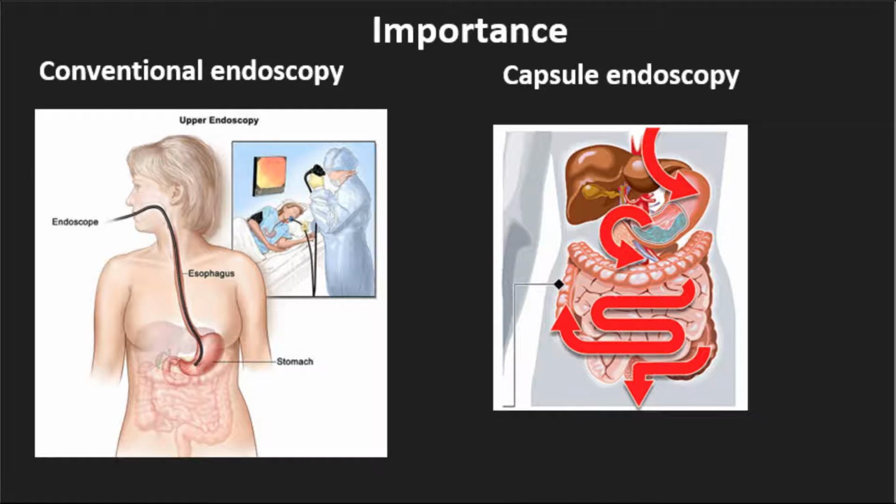The endoscopy allows the doctor to diagnose your internal organs without making large incisions. It helps the doctor gain a more accurate understanding of the possible cause of your symptoms, and it also helps them determine whether the condition can be treated without surgery or with endoscopy.